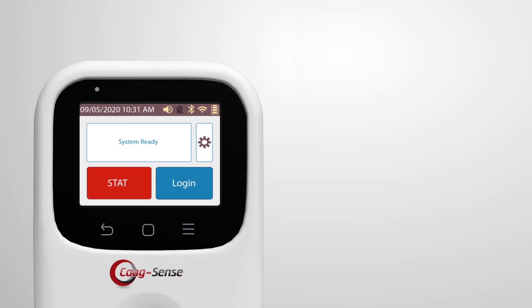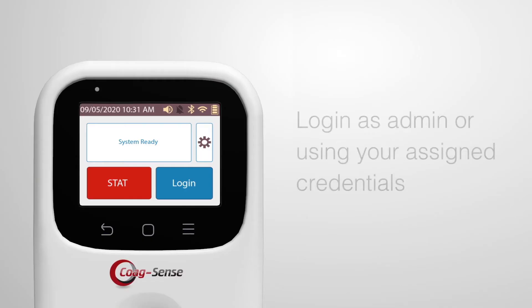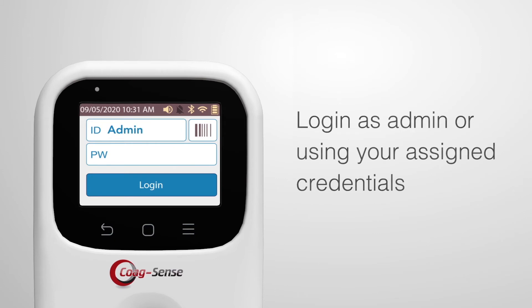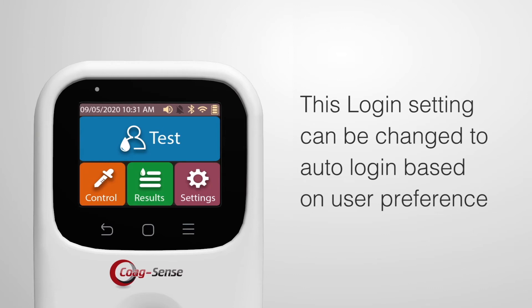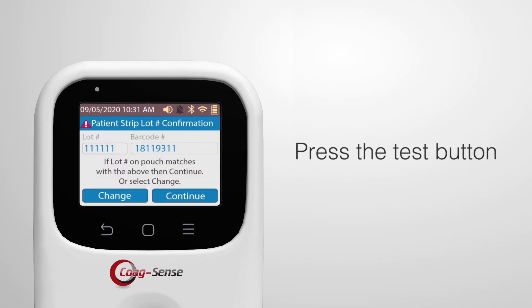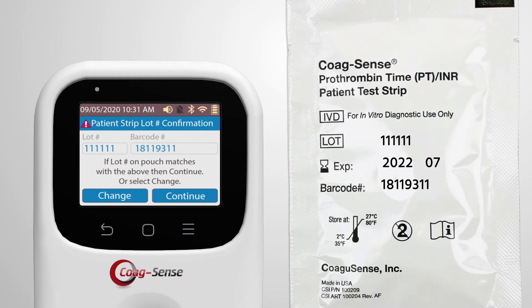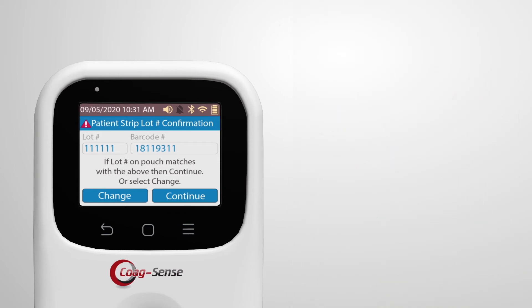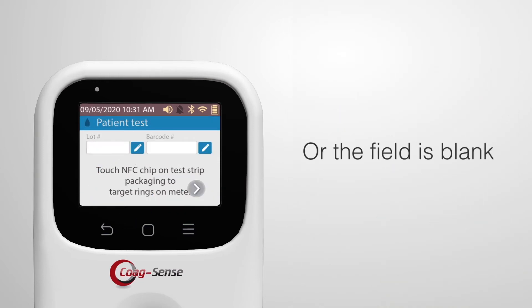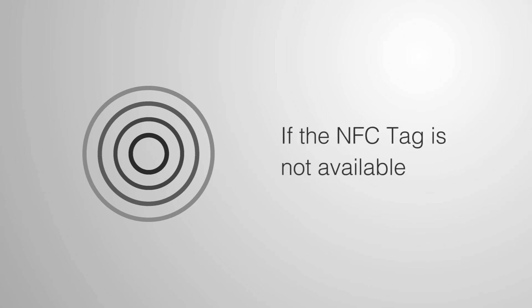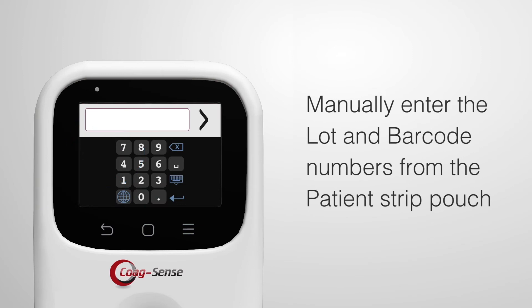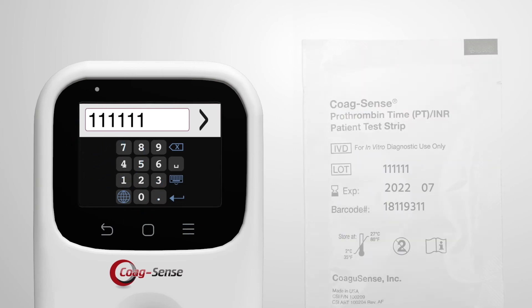When the system finishes starting up, the login screen will be displayed. Log in as admin or using your assigned credentials. This login setting can be changed to auto-login based on user preference. Press the test button on the color touch screen. Confirm that the patient strip lot number and barcode number displayed matches the information on the test strip pouch. If the number does not match or the field is blank, touch the NFC tag to the NFC scanner. If the NFC tag is not available, manually enter the lot and barcode numbers from the patient test strip pouch.